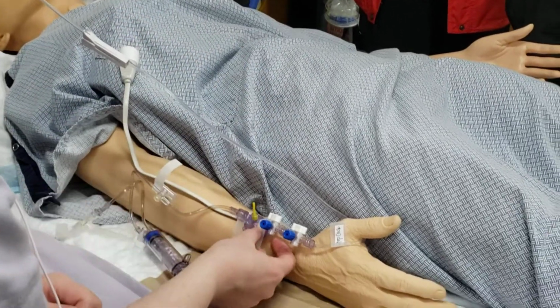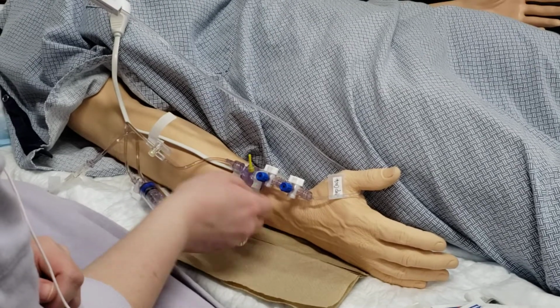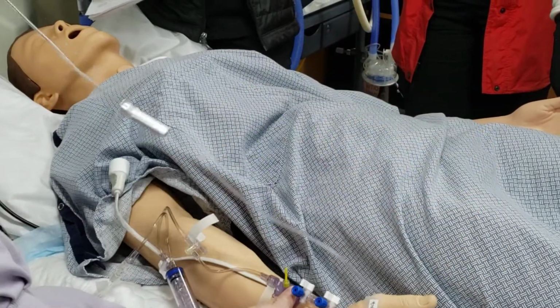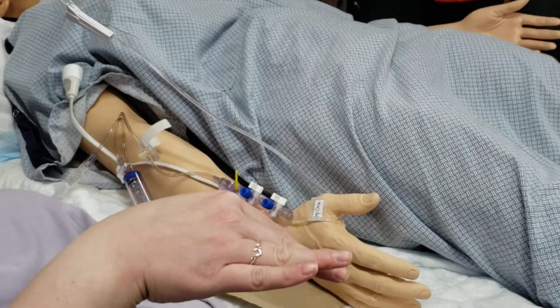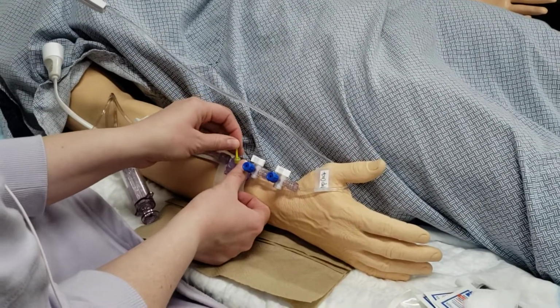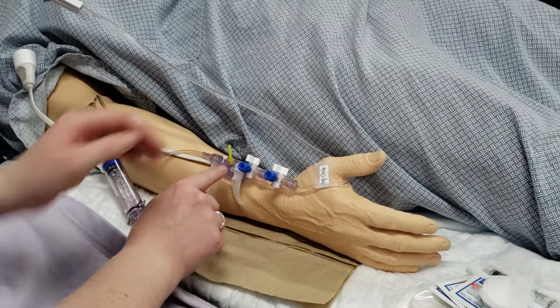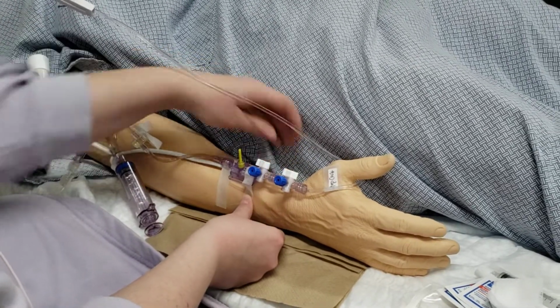It is best to keep this at the level of the heart, because if it goes above for some reason, you're going to have a low blood pressure, or if it goes below, you're going to have a high blood pressure. So it's best to try to keep it as level with the heart as possible. This is the pigtail, which opens up that line to allow it to flush, and we'll bring that back in just a little bit when we learn to draw.